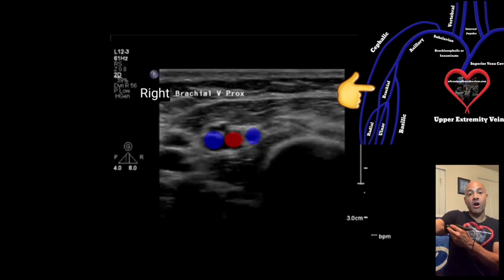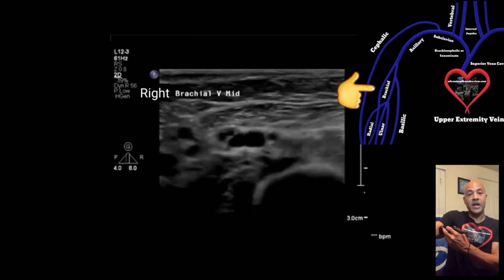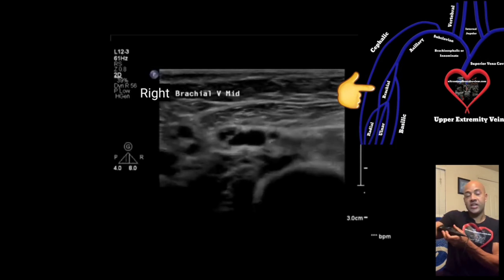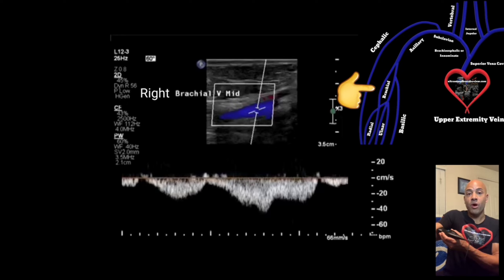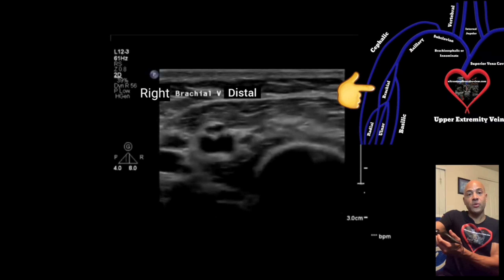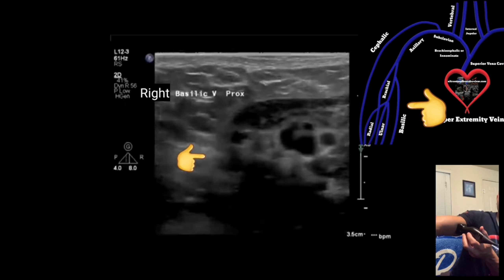Next we're going to look at the brachial veins. Start in the transverse view on the medial side of the patient's upper arm until you see the Mickey Mouse view — the brachial artery flanked by two brachial veins. Acquire an image of you compressing both veins. Then move to the mid area and take another image compressing the brachial veins. Turn to the sagittal view with the index pointed towards the patient's head, turn on color, and acquire an image. You don't have to use spectral Doppler waveforms if you don't want to.